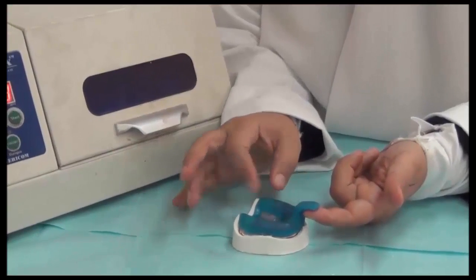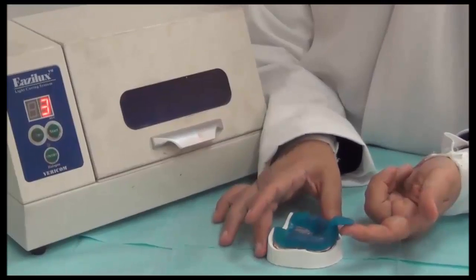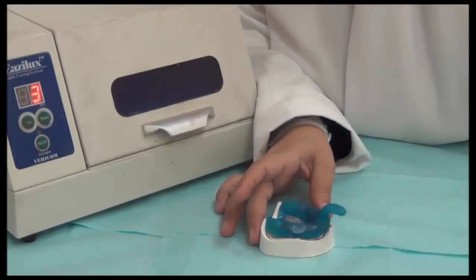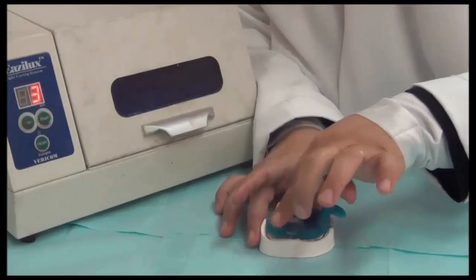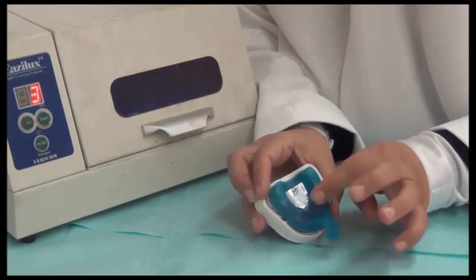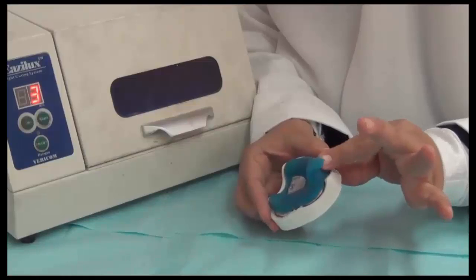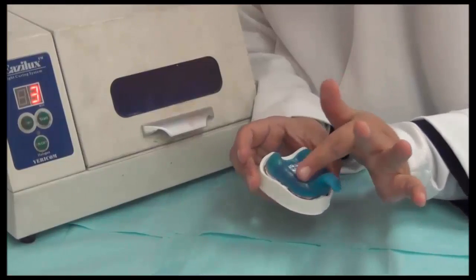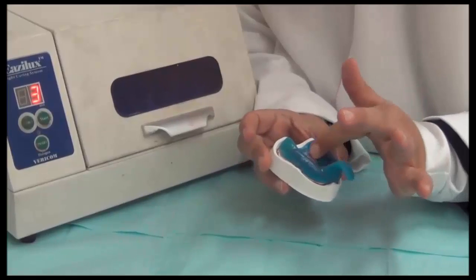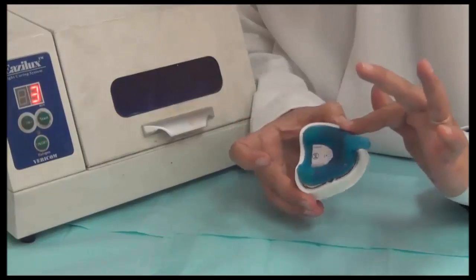Another issue is that the light cure acrylic material has what we call an air inhibited layer. This layer does not fully set on the surface because of its contact with oxygen. So we could add Vaseline to the surface. This will reduce the air inhibited layer. And also Vaseline will aid in the fusion of the body of the handle to the tray material. It will smoothen the surface, aid in the adaptation of the handle to the body of the tray, and prevent the air inhibited layer. So once the material sets, we will not have the tacky part on the surface.